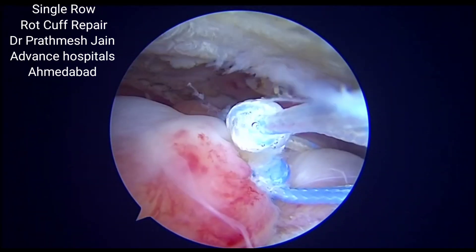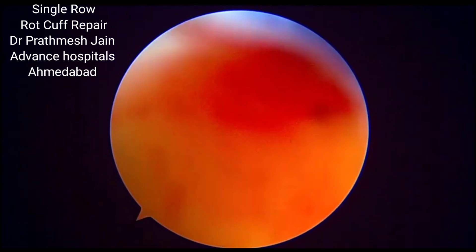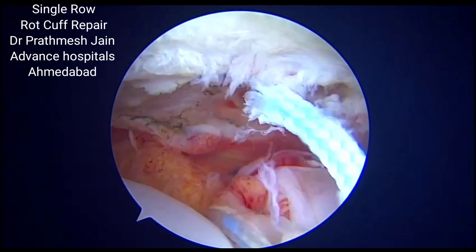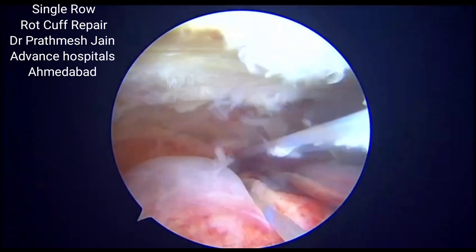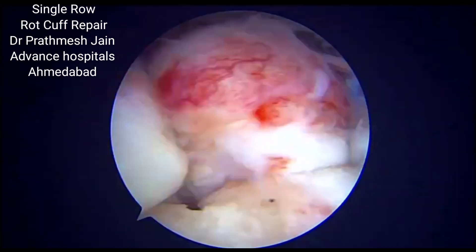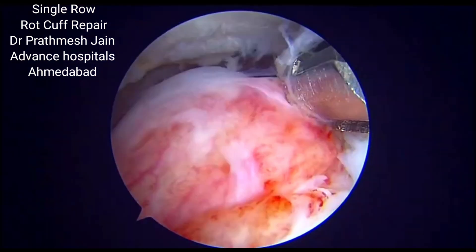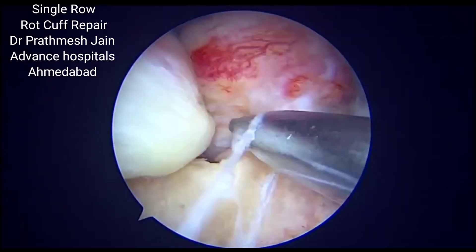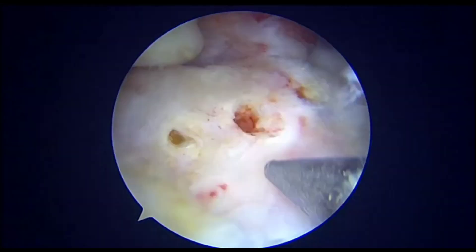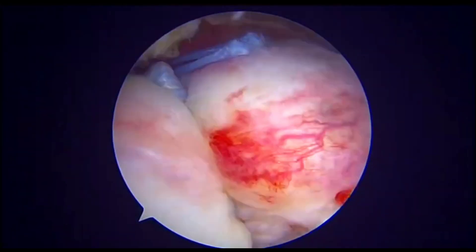Once you are done with the repair, once you have put the suture anchors and the knots into place, you can cut the suture limbs. This is your final construct, which includes two anchors repairing the rotator cuff in a Mason Allen fashion. The part of the rotator cuff footprint that remains uncovered on the lateral part can be treated with small microfractures or small holes. This is what is described as the crimson duvet by Steve Snyder, and this will increase the bleeding and ensure that good healing will take place.